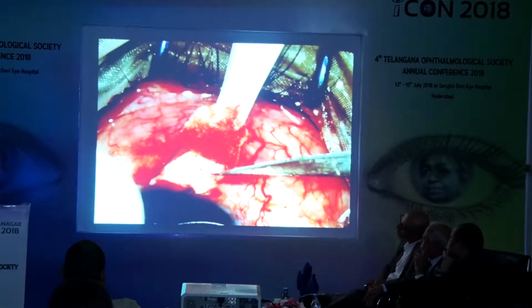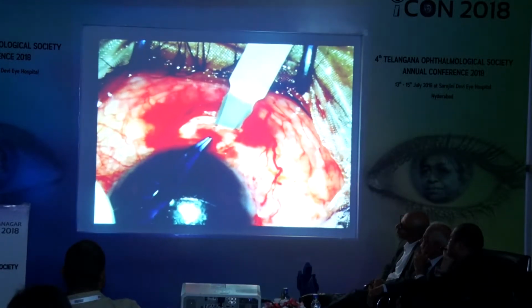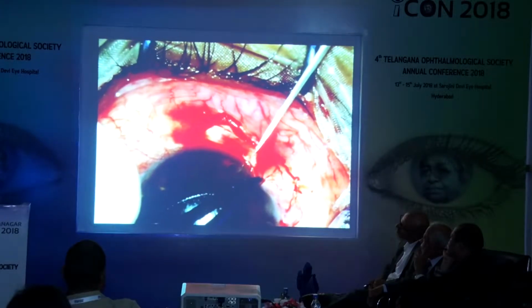In the absence of availability of a scleral patch graft, autologous partial thickness sclera was harvested from the opposite limbus.